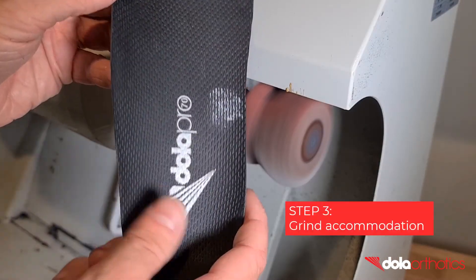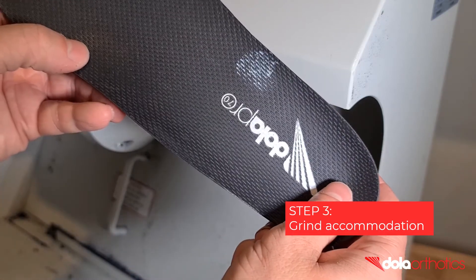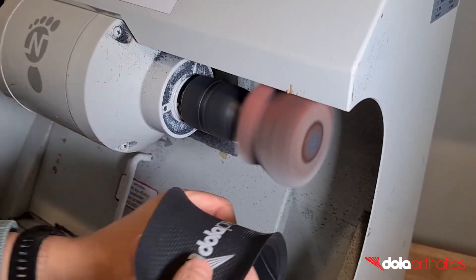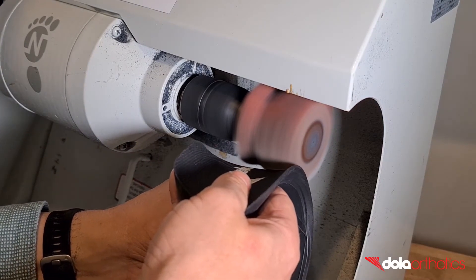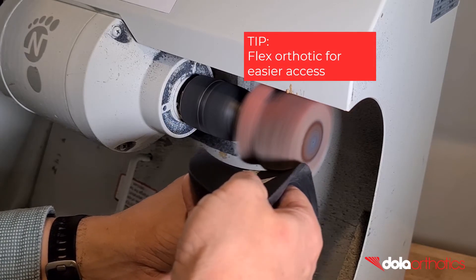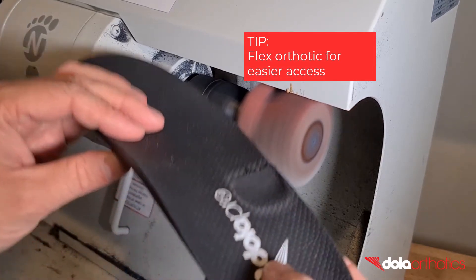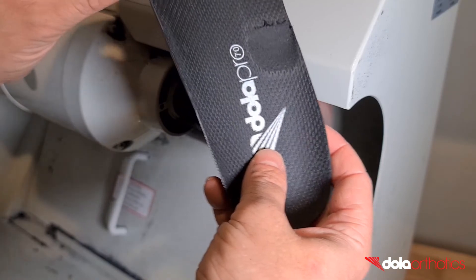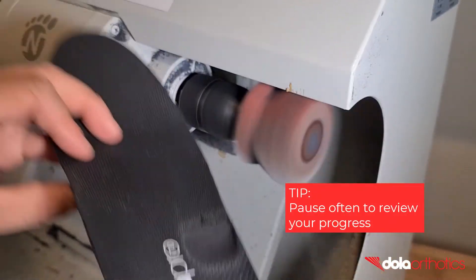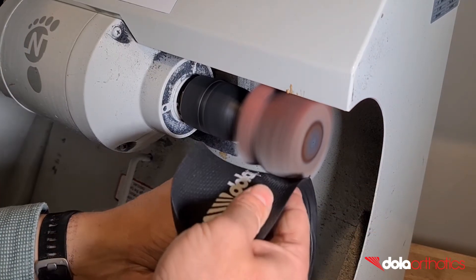The aim of grinding is to remove the orthotic shell material at your mark to the depth required. Holding the orthotic shell medial and lateral to the grinding area, place the dorsal surface of the orthotic shell against the edge of the grinder. Flexing the orthotic will allow easier access to your grinding mark and will protect you from grinding unwanted areas, including the heel cup. Remove small sections of the orthotic at a time until you become comfortable and check your progress.